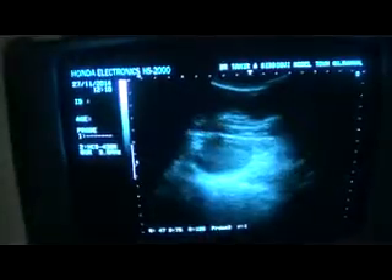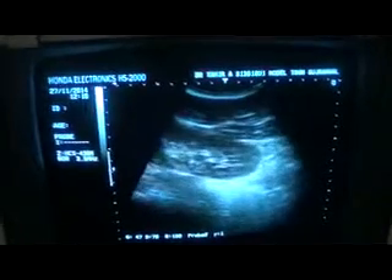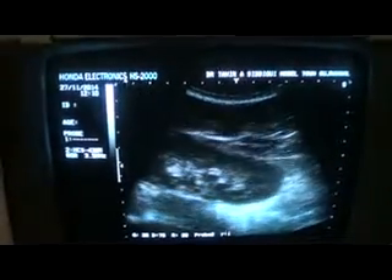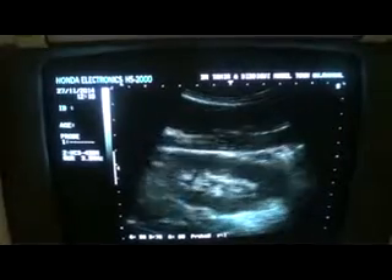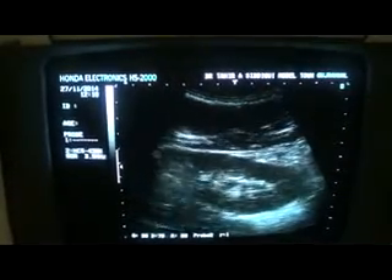Now, first the right kidney. I have got it. Now I am going to angle it a bit — going upwards slightly — and I am getting the kidney in longitudinal section. This is the right kidney. Now the left one: going towards the left side of the vertebral column, and here I get the left kidney in longitudinal section.